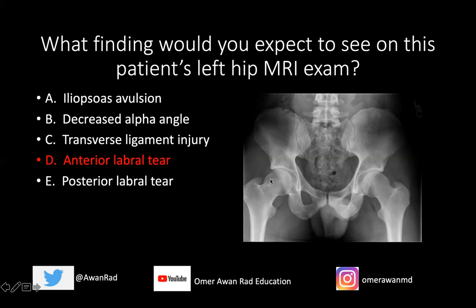They also have that on the right side as well. There's lack of offset — normally you have a nice concave offset at the femoral head and neck junction, but instead we have this osseous protuberance here suggesting CAM type FAI.